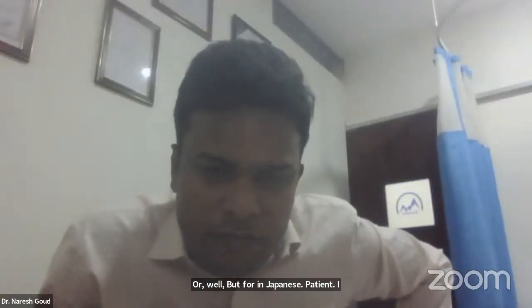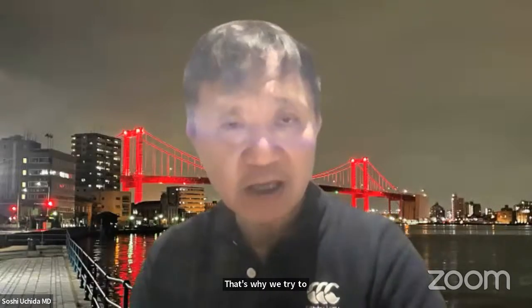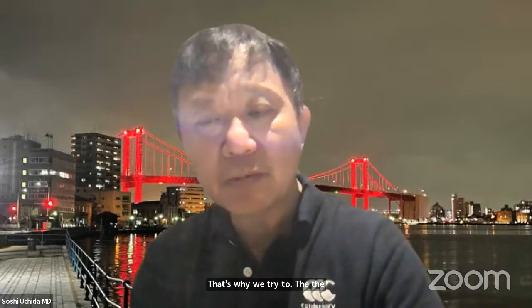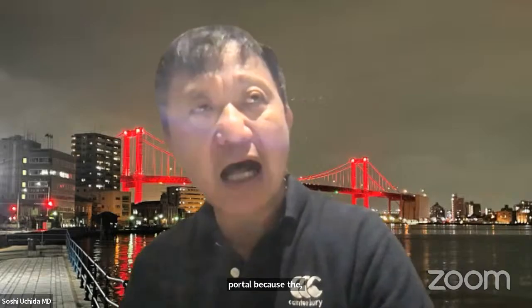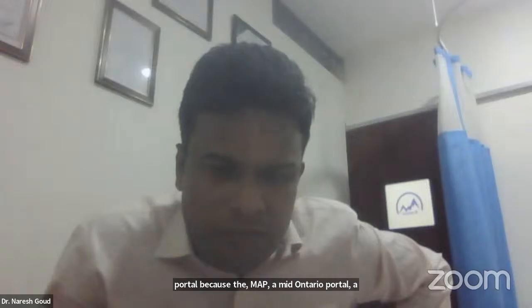But in Japanese patients, I think hip instability or capsular laxity is more prevalent than in the US. That is why we try to repair the capsule, at least for the mid-anterior portal, because the mid-anterior portal is usually located in the iliofemoral ligament.